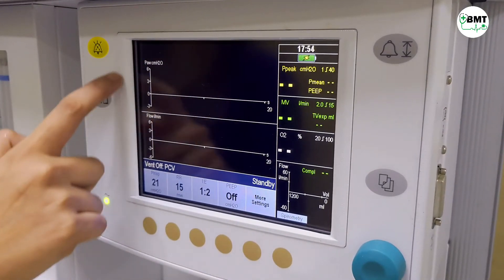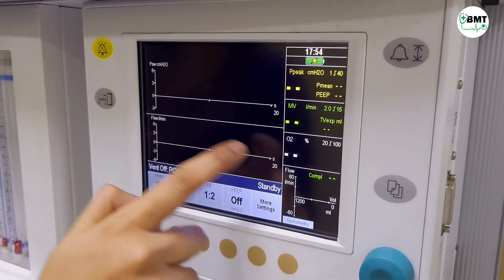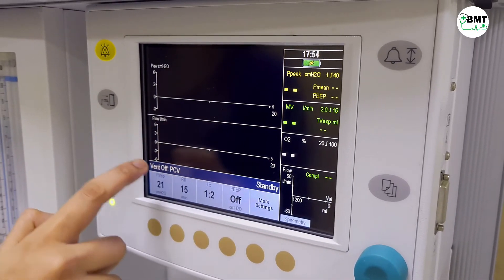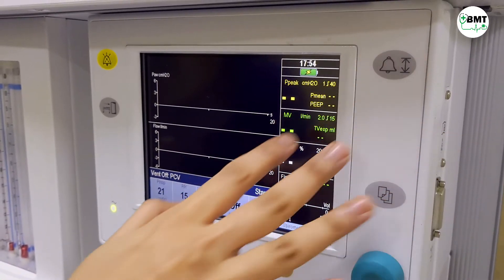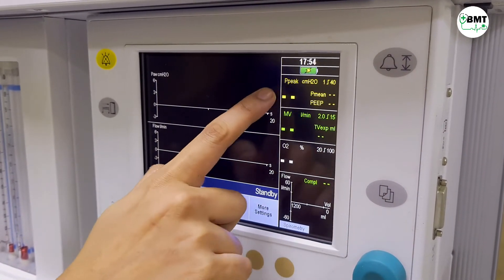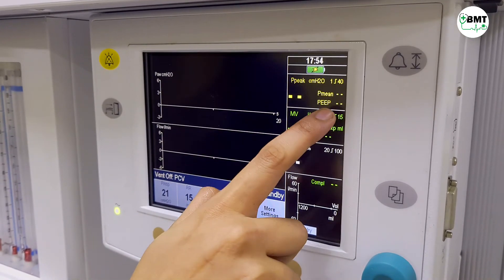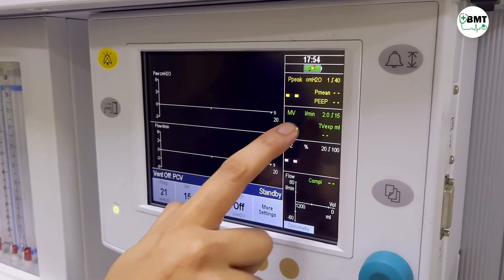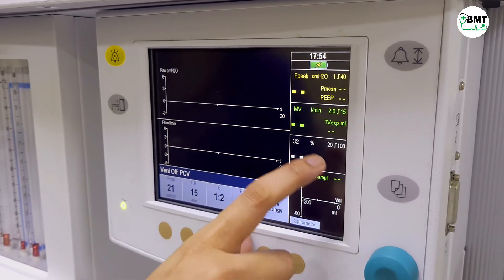This is the airway pressure graph and this is the flow graph. This is from the patient side. Peak value. Mean pressure. Minute volume.